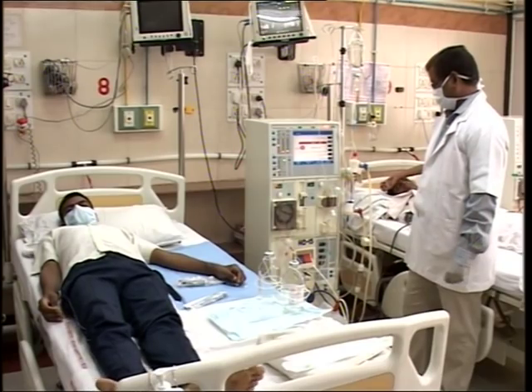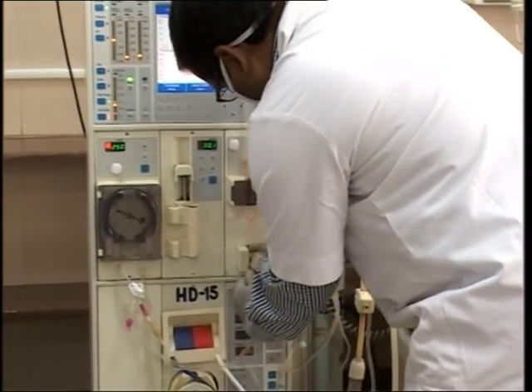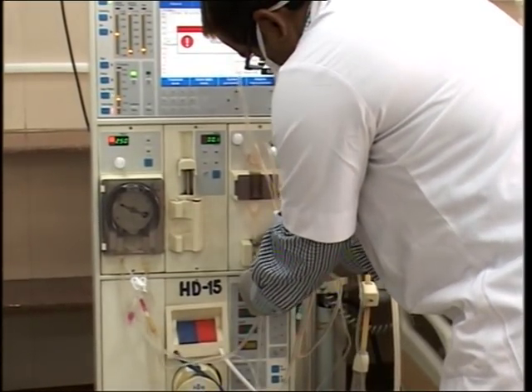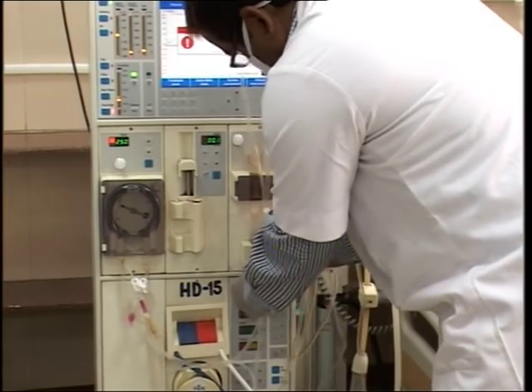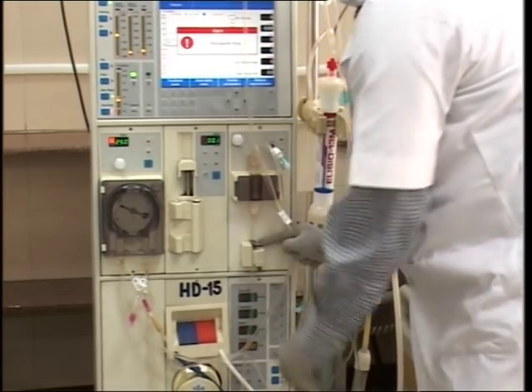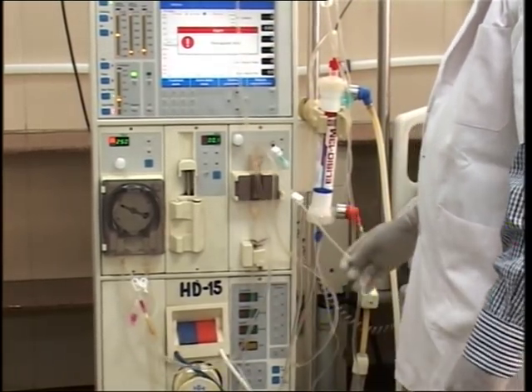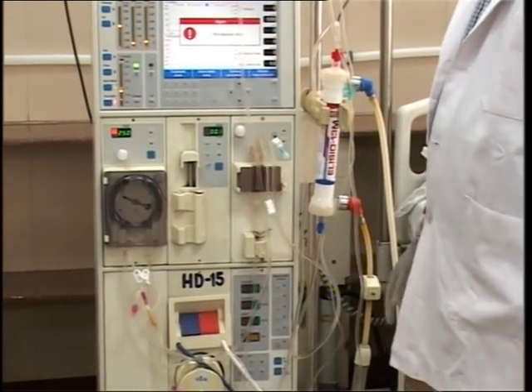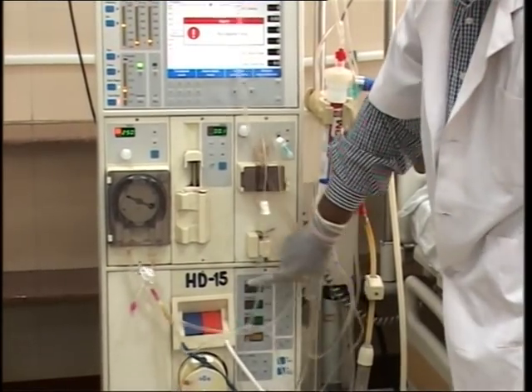Attach the venous tubings to the air detector clamp below the venous drip chamber. The venous drip chamber is equipped with a solenoid valve to detect air, and once air is detected, it automatically clamps the venous line and stops the blood pump.